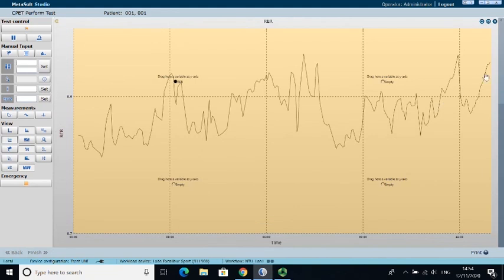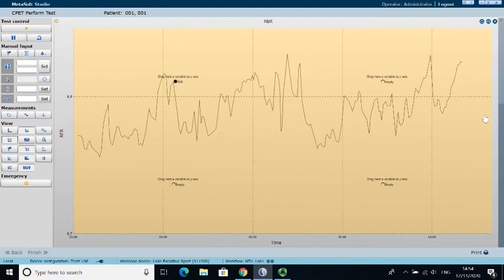Okay, I'm not entirely sure why I've gone to RER there. There's not really much of interest, but we're going to start to see that number increase because we're going to start to use more glycogen and glucose, or carbohydrates, for our energy source, and then we're also going to have a contribution of anaerobic respiration, which is going to shoot up our RER. But you can't really see too much of that at the minute, so I'm not really sure I've clicked on it.